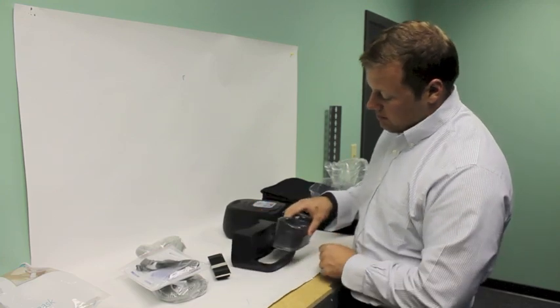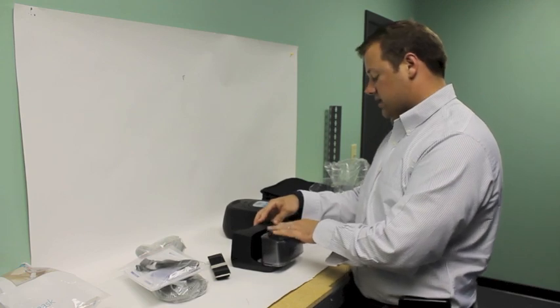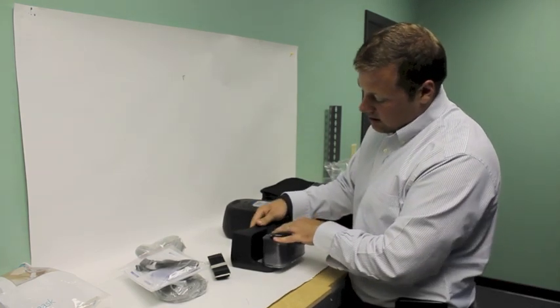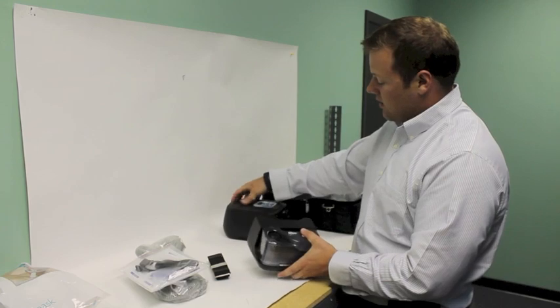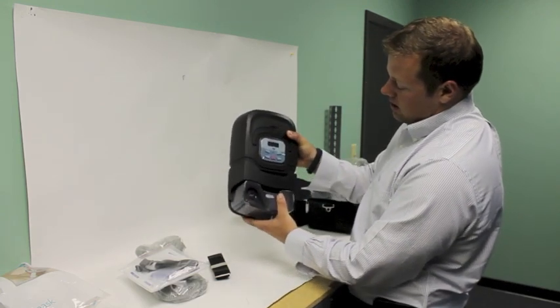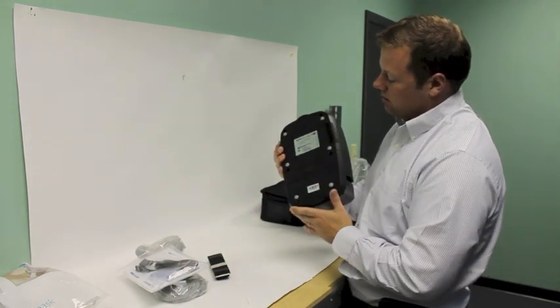So then to put the water chamber back on, you have these little guides right here. You actually have to, like I said, compress the spring of the heating plate right there, compress it to attach it right on, then you know it's there. And then to put it right back on the machine, it's no different, just lining up, and then you'll hear it lock. This little button will pop out.